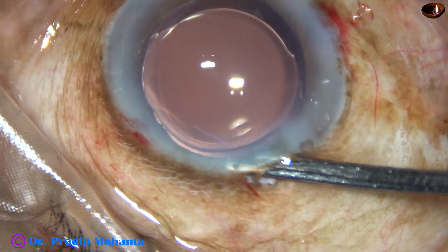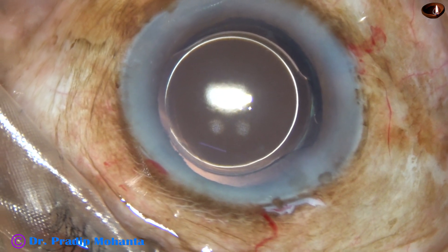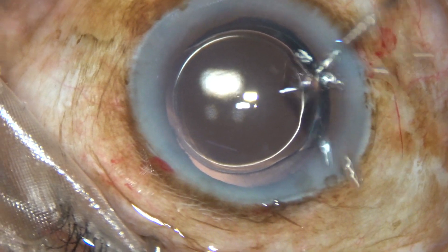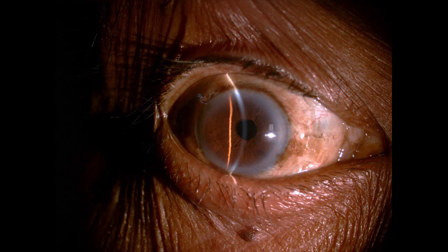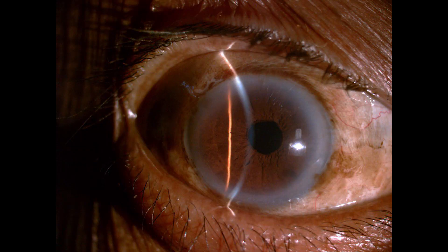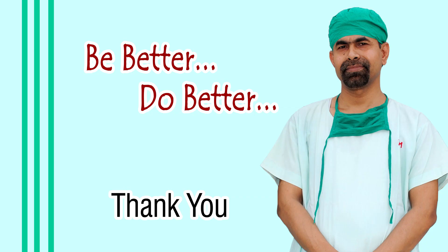The anterior chamber is nicely formed and the case is concluded. The integrity of the wounds is checked. A few drops of moxifloxacin are applied. This is some post-op pictures after 24 hours — the anterior chamber is quiet, intraocular pressure is normal, vision is 6/9. See how clear the cornea is, and I have used only 2% HPMC. This is the beauty of submarine chop — you deliver all the ultrasound energy inside the lens mass, and the cornea remains clear like this. Thank you very much for your attention.